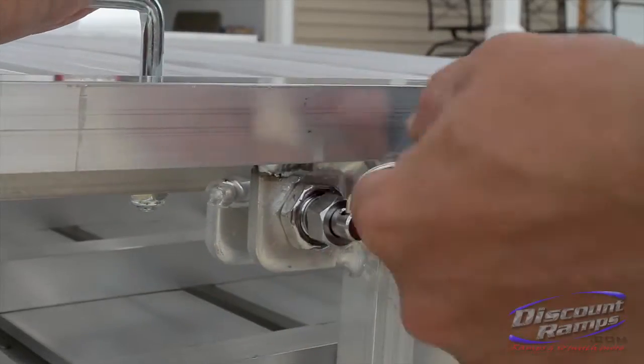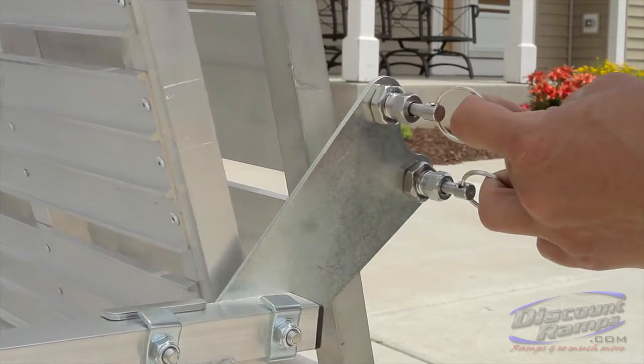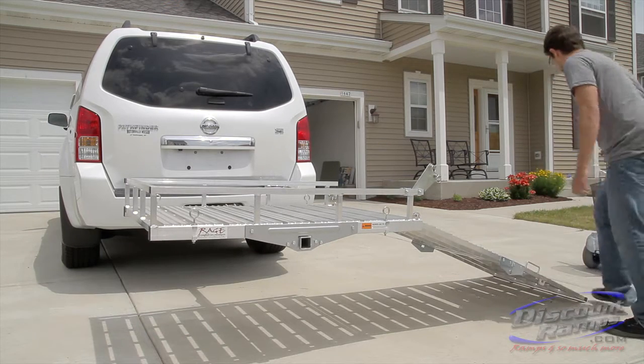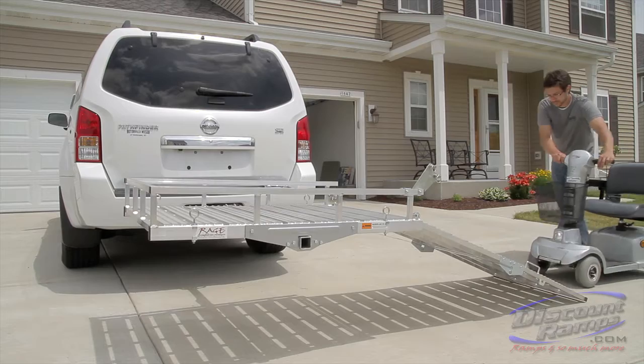To begin loading your mobility scooter, pull spring pins and unfold the loading ramp completely. Slowly push the unoccupied scooter into the carrier.